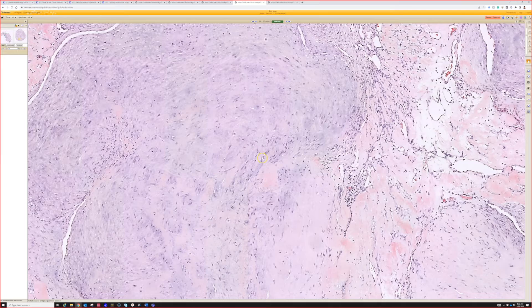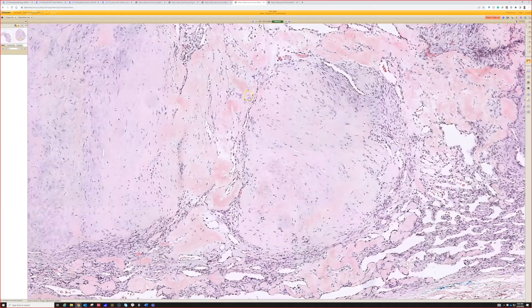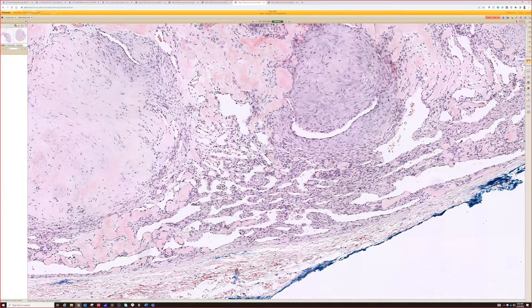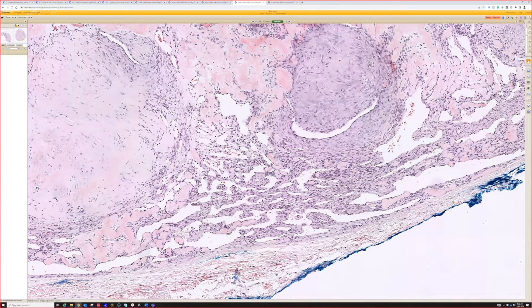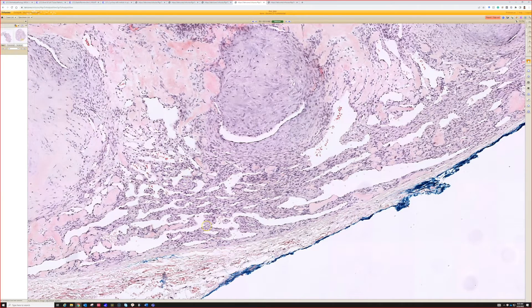Then in between the nodules you have a more cellular spindled or sometimes even round cell blue cell population with these really prominent branching vessels.